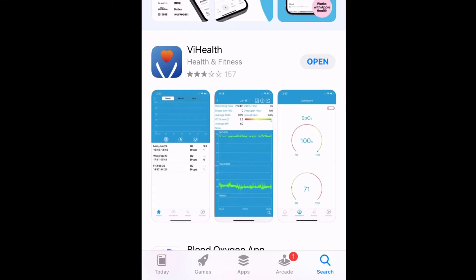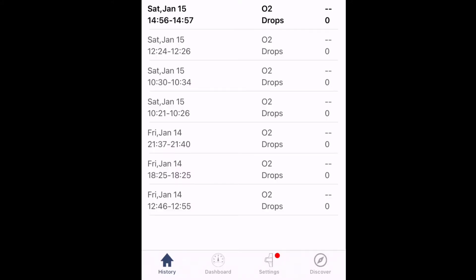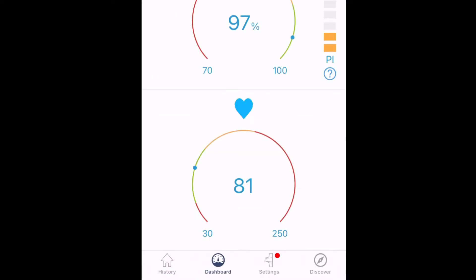Let's go into the app. Whether you have an iPhone or Android, go to VI Health — I already have the app downloaded. It's going to sync in; I already have it synced to my oxygen monitor. It picks it up automatically. In the app, we have history, dashboard, settings, and discover. Let's go into dashboard first. My oxygen level is 97% SPO2 and my heart rate is at 82, now dropping to 75. Pretty good, no complaints there. You can see the range of 70 to 100 for oxygen levels — if it falls below 70, that's not a good thing.